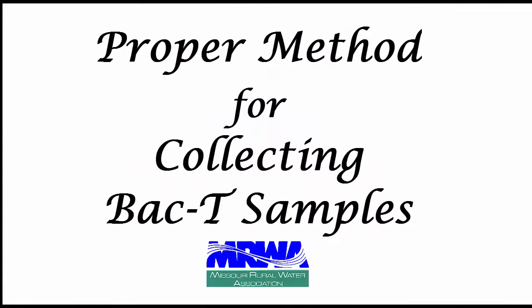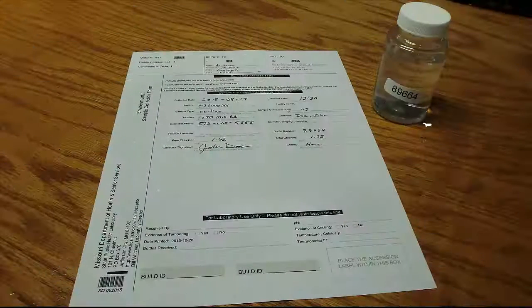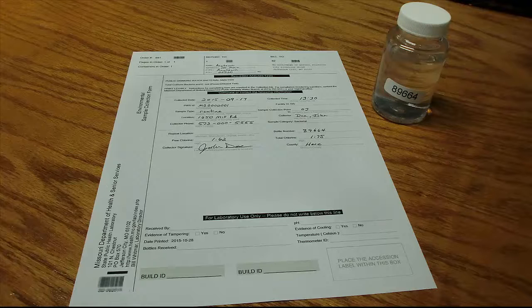This video will demonstrate the proper method for collecting bacteriological or BACT samples. All public water supplies must collect and submit at least one sample each month to test for total coliform bacteria.